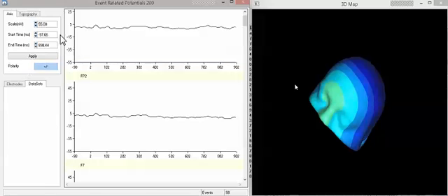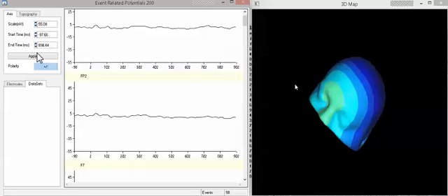Once you set that up, then this event-related potential panel comes open in which you can determine the scaling of the potential in microvolts, as well as the latencies.